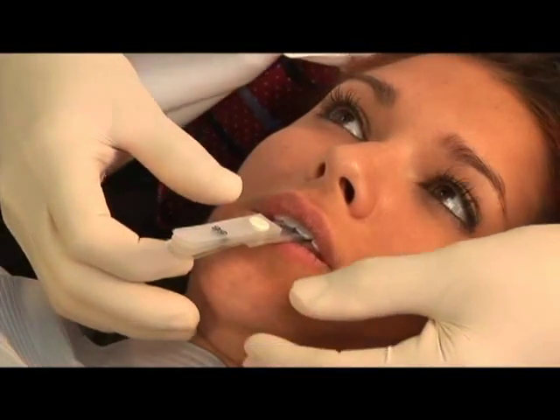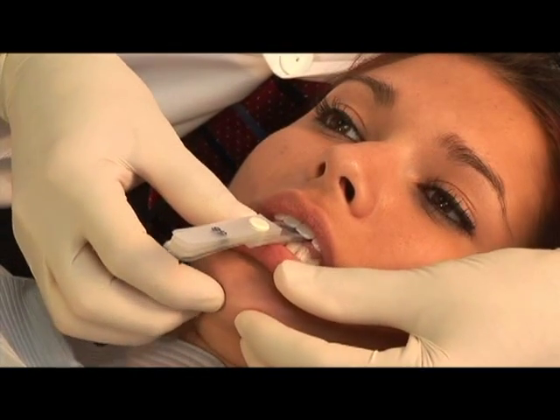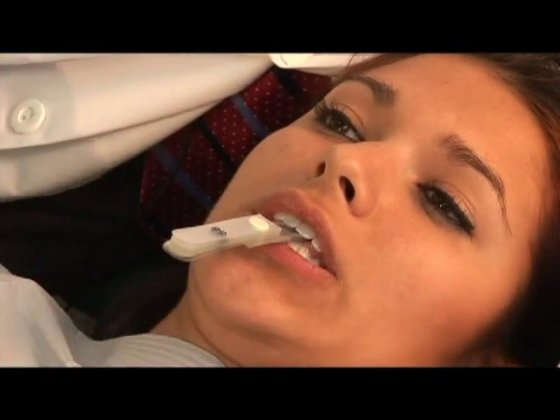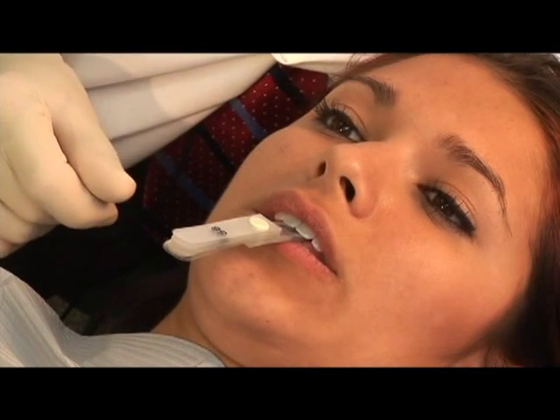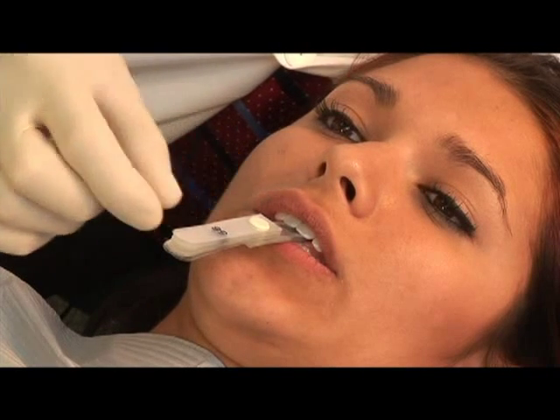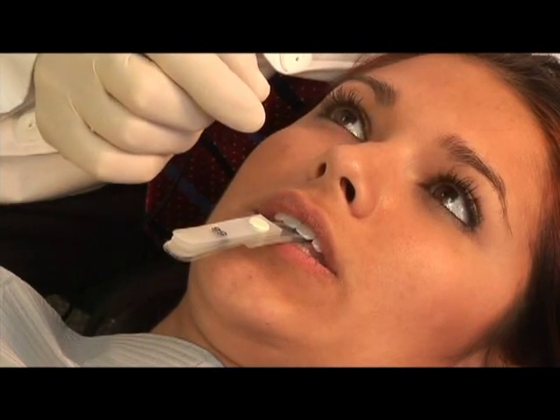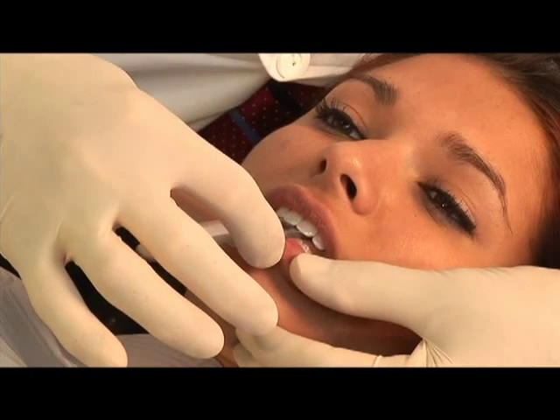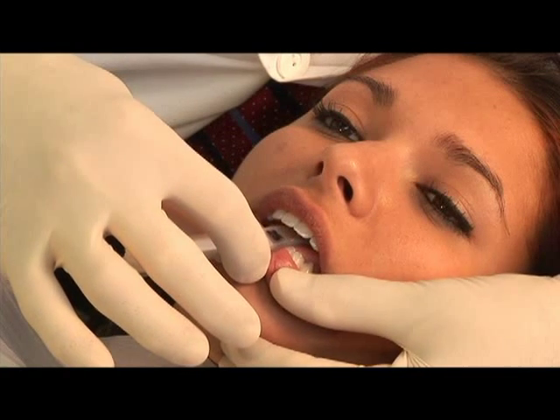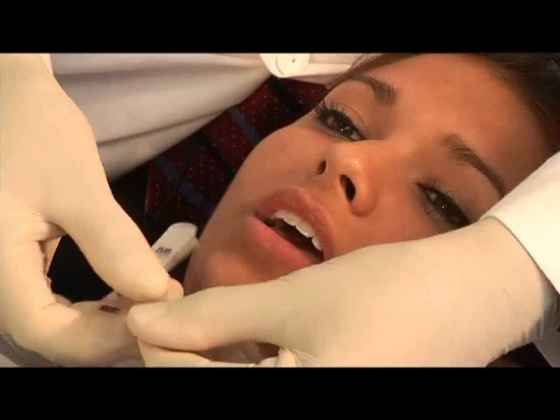Okay, Lauren, I want to check to see where your first tooth is touching here. There's going to be a tooth touch somewhere in your mouth first before the others with your jaw joint hinged like this. So what I'm going to do is take away a few of the leaves on the leaf gauge here until we find that first point of contact. Okay? Now, I need for you to open here for me slightly, a little bit more. I want you to stay open like that. Don't let anything close.